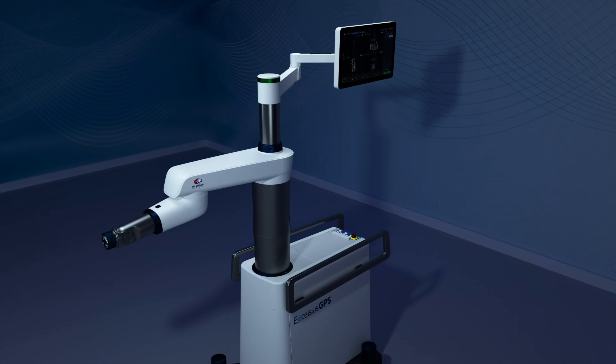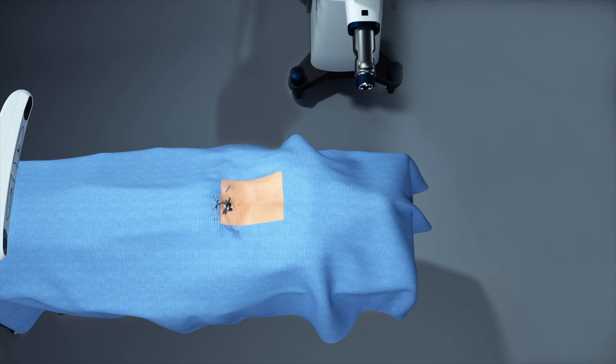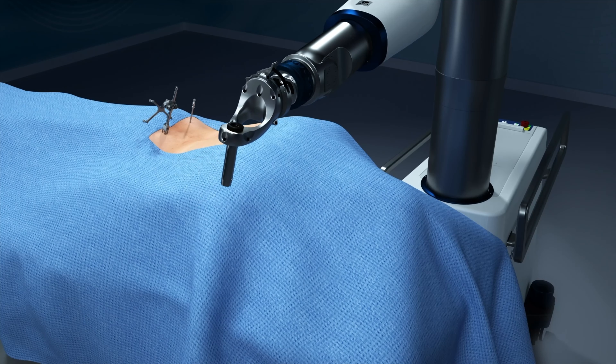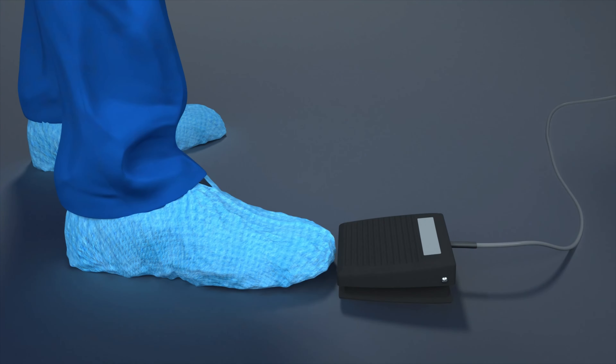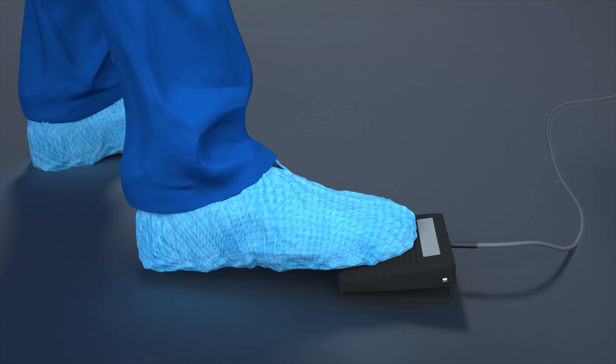Once the plan is made, the robot is moved and placed near the surgical site, and the active end effector — the hand of the robot — is attached. The surgeon selects which screw will be robotically navigated first, and engages the robotic arm by pressing the foot pedal.